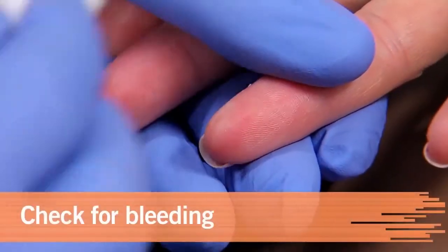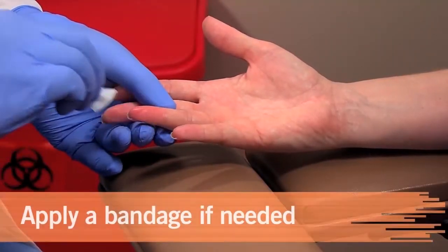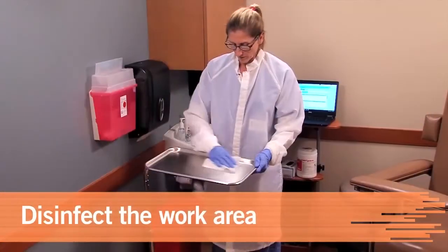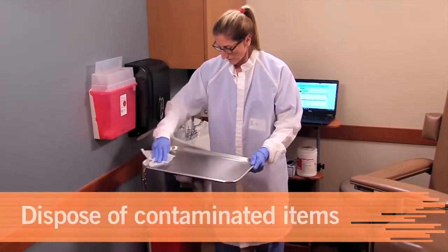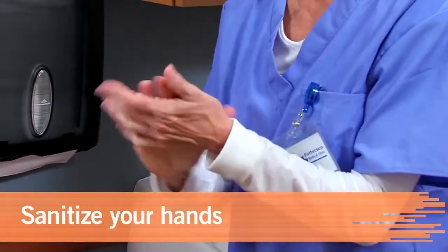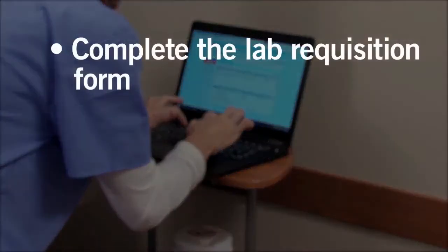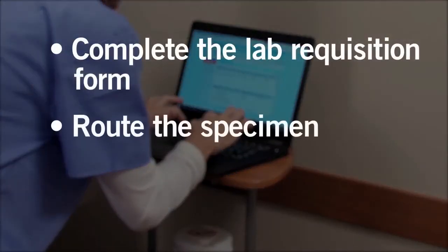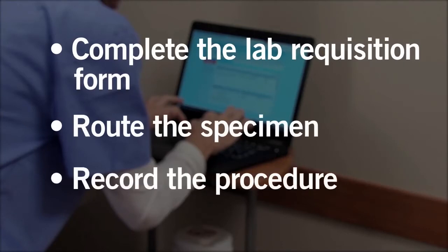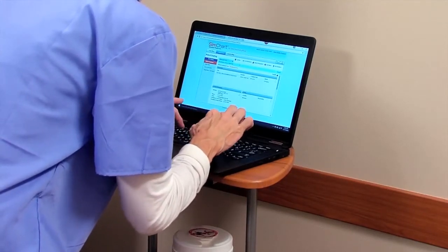Check the patient for bleeding and clean the site if traces of blood are visible. Apply a non-allergenic bandage. Disinfect the work area. Use the biohazard waste container to dispose of blood-contaminated materials. Remove your lab coat and gloves and sanitize your hands to ensure infection control. Complete the laboratory requisition form and route the specimen to the proper place. Record the procedure in the patient's record — a procedure isn't considered done until it's been recorded.